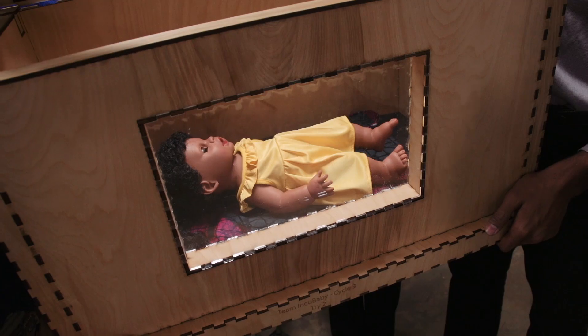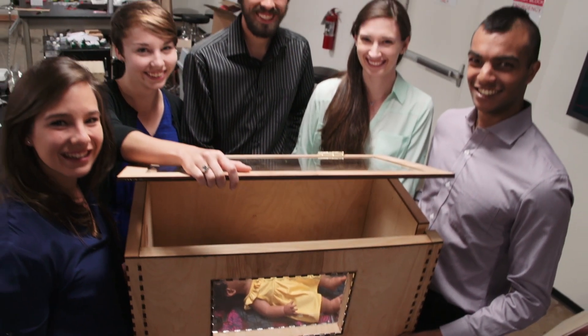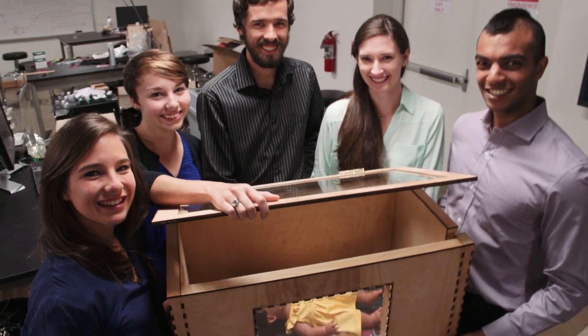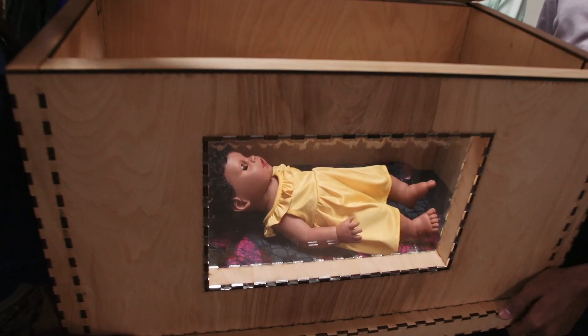I'm with Team Incubaby, a multidisciplinary group of senior engineers here at Rice University tasked with designing a low-cost neonatal incubator for the developing world.